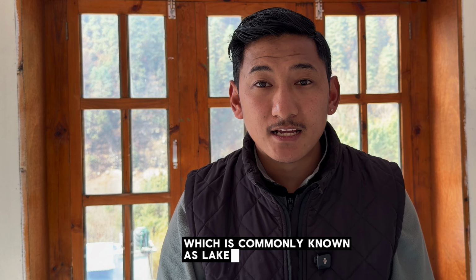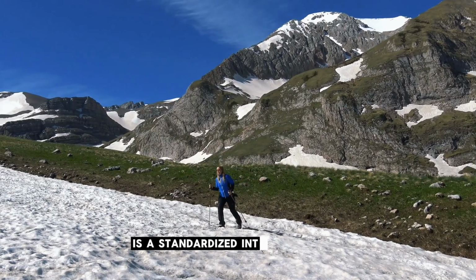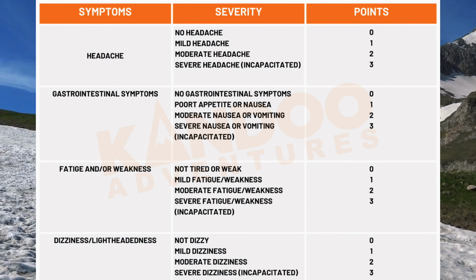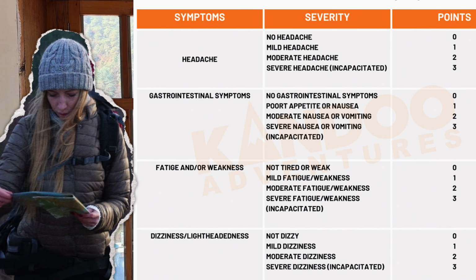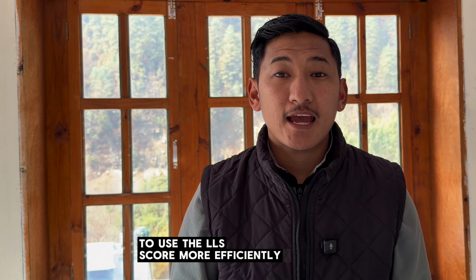It is a must that you measure your oximeter along with keeping the score of LLS, which is commonly known as the Lake Louise Score. The Lake Louise Score, LLS, is a standardized, internationally recognized scoring system used to diagnose and quantify the severity of acute mountain sickness, AMS. LLS is a simple questionnaire where you assign a score from 0 to 3 to 5 key symptoms. You should be above an elevation of 2500 meters to use the LLS more efficiently and meaningfully.